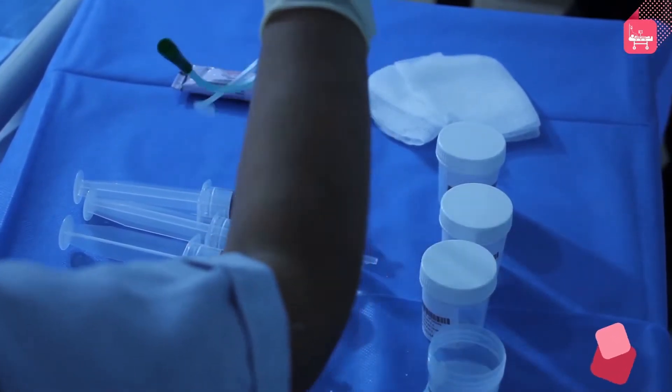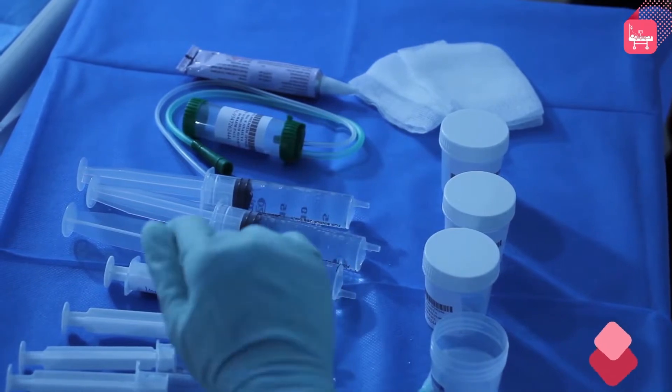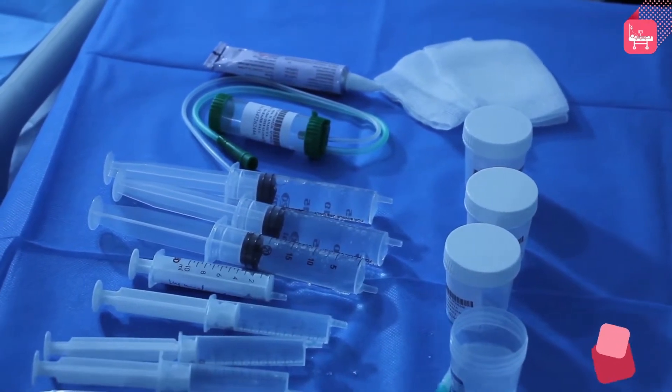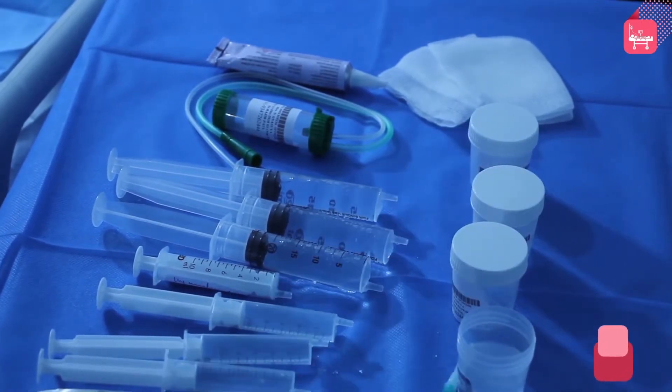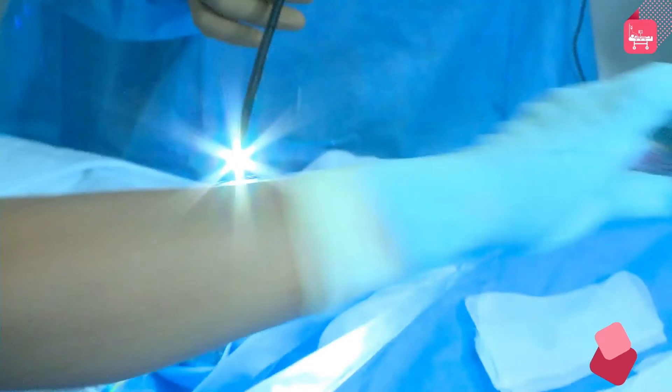Before the bronchoscopy procedure, equipment such as lignocaine jelly, used for the lubrication of the bronchoscope and airways, mucus extractor, syringes filled with saline, syringes filled with lignocaine injection, and the containers used for the collection of the sample should be kept ready.